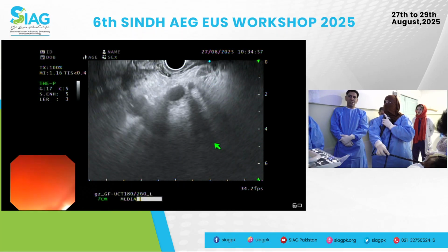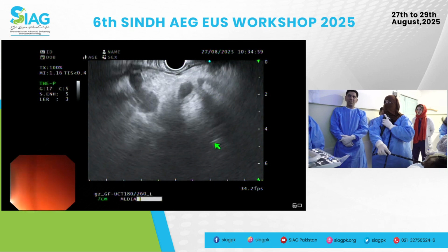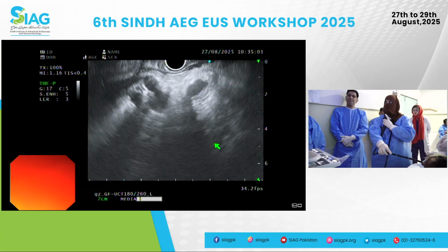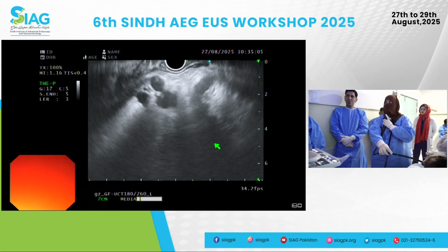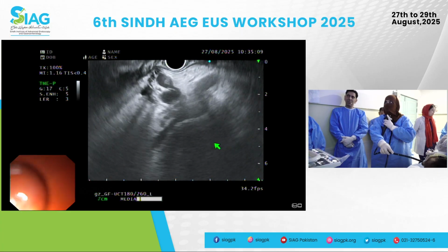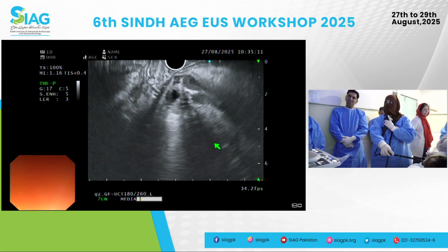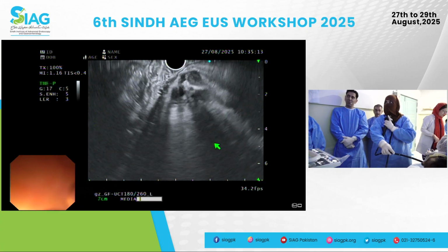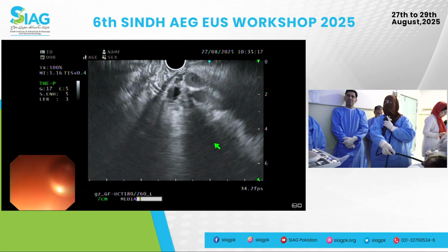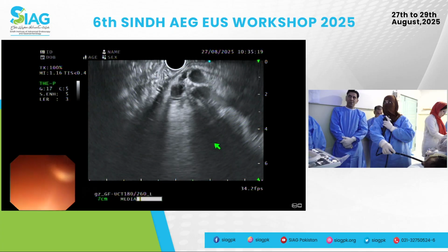There should be no resistance. It should be smooth, you should be able to advance it. Are you able to advance it? Slowly. Good. Keep advancing. Splenic vessels coming in. Good. Keep advancing. Good. Feel away, towards you. This is the pancreas. We'll find out soon.